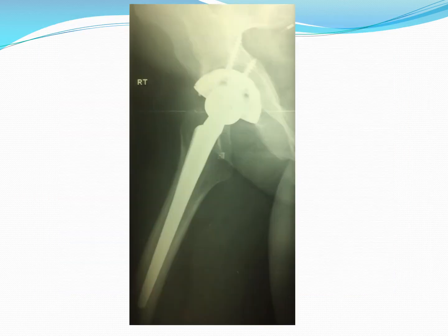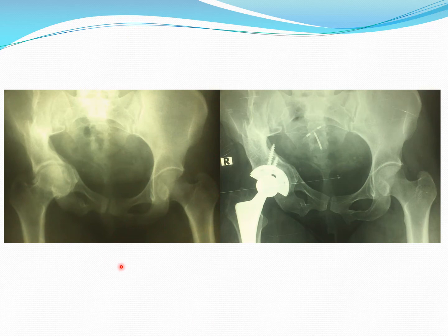This is the lateral view and this is the final view. I make the two X-rays in almost the same position and size so you can make your comparison.